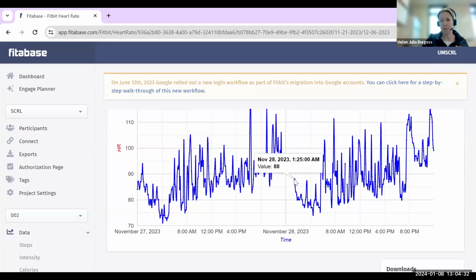I do think that you will have to scan heart rate on a day-by-day basis for any night that you're considering getting sleep from in order to feel confident that you are fully capturing the sleep.